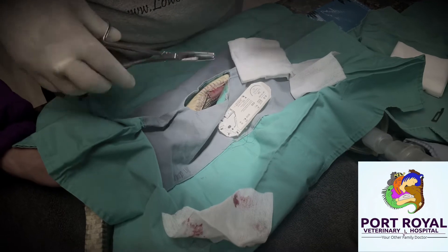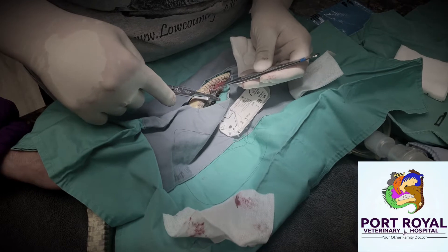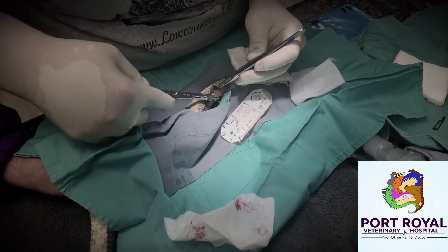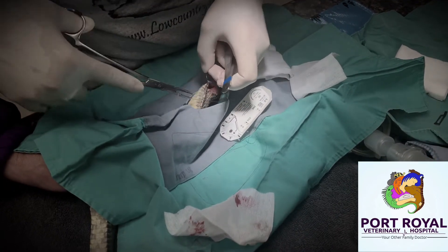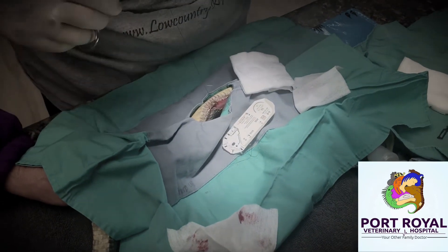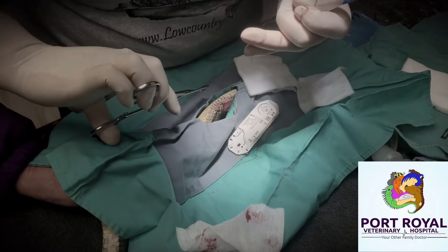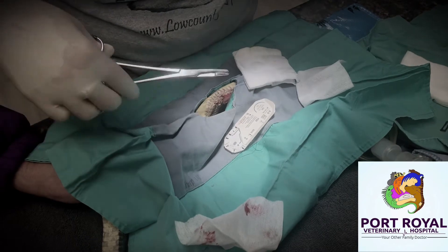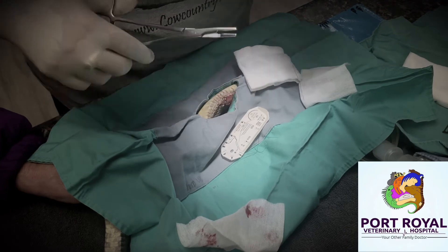After removing the egg, the esophagus was sutured closed and then the skin. This is an x-ray of the garter snake post-surgery.